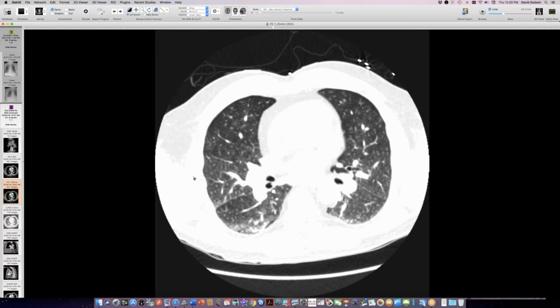So the remarkable thing here is that just a small number of tumor cells can induce thrombi, and the lesions that we're seeing here are mostly these microthrombi. It's not really tumor cells that we're seeing causing these visible dots. These macroscopic dots that we can see on CT are the thrombus induced by a small number of cancer cells.